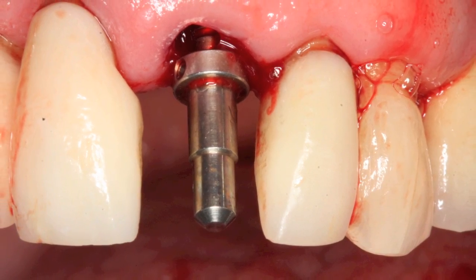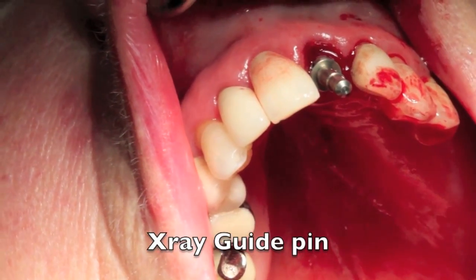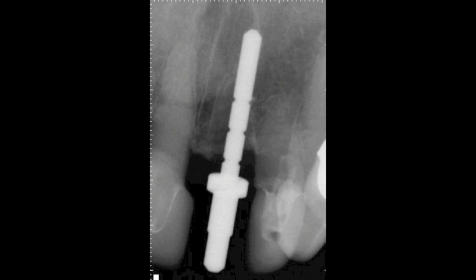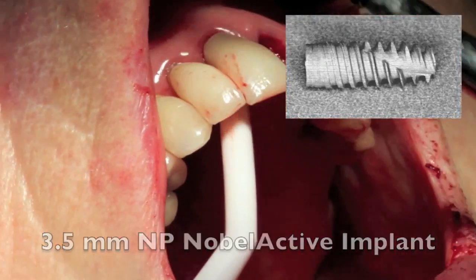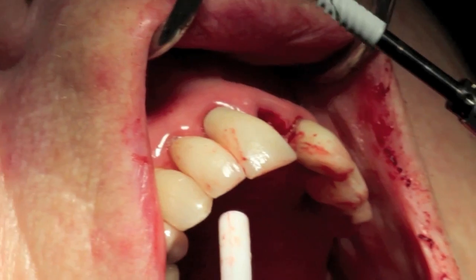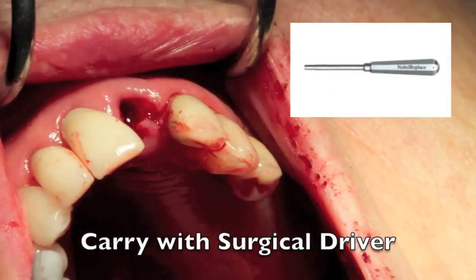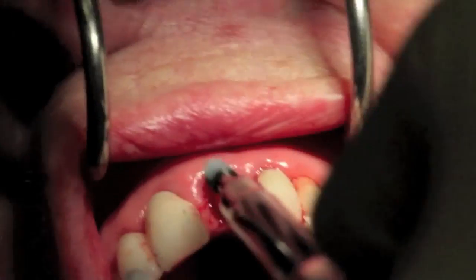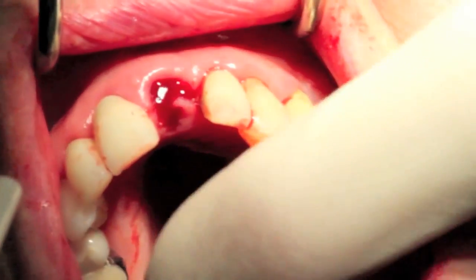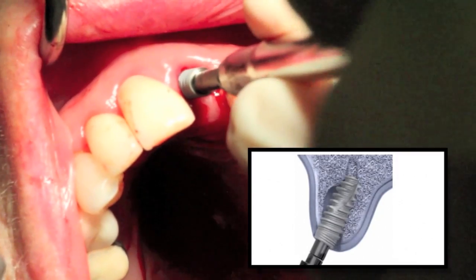To check our angulation, it's important to place an X-ray guide pin, and then we're able to visually see that we're in a good position. But taking an X-ray is also always prudent, to make sure we're in the right position mesial-distally. So we're going to place a 3.5mm narrow platform Nobel Active, and using a surgical driver, which is the choice of instrument here, we're going to take the implant to the mouth, carrying it with the surgical driver. Now the surgical driver is going to enable us to position this in that palatal position.